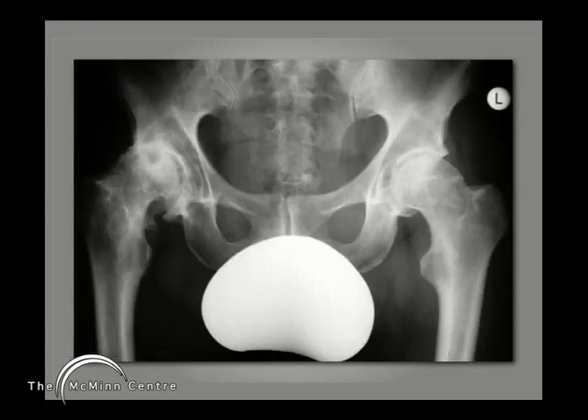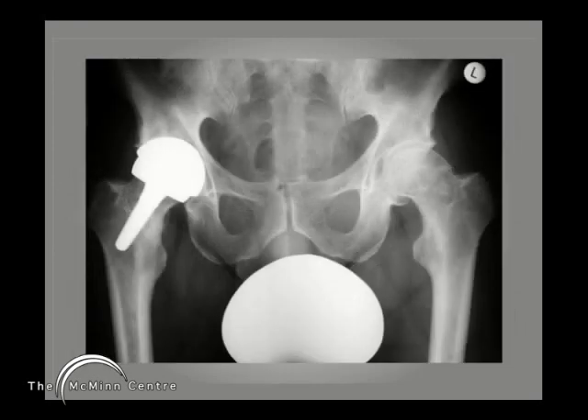A simpler situation here. A young patient who wanted a Birmingham hip resurfacing, but he had cysts in the summit and in the supralateral aspect of his eroded femoral head — just not suitable for a Birmingham hip resurfacing. Instead, I was able to do a BMHR, and you can see there we have kept this implant system for this young man conservative.